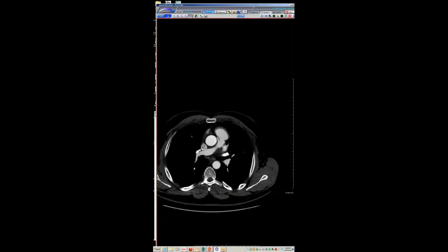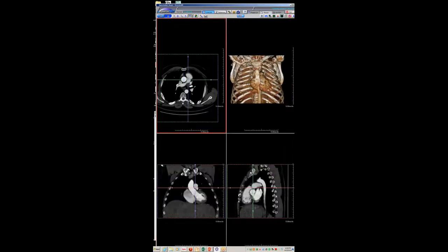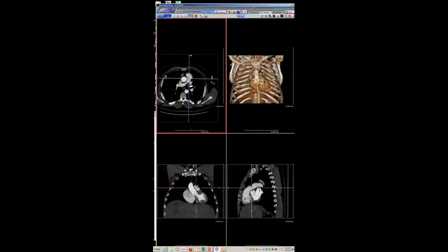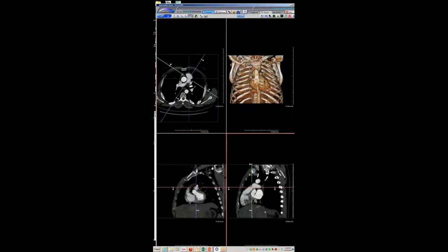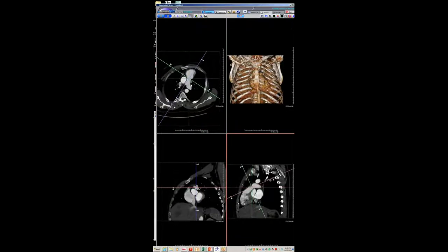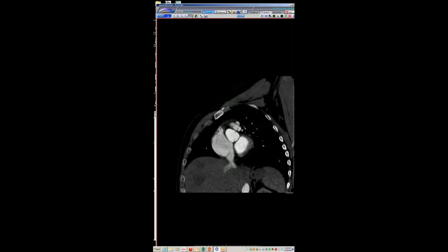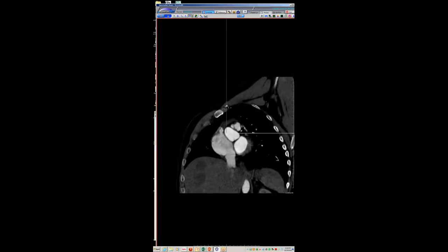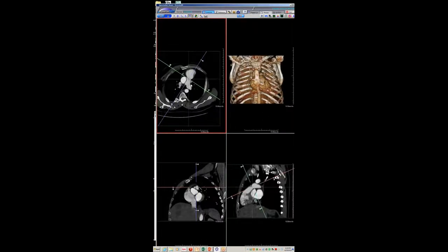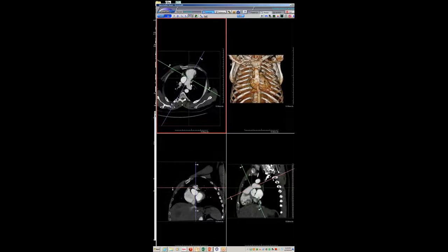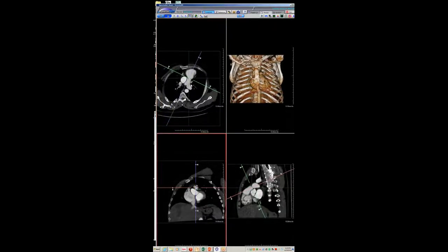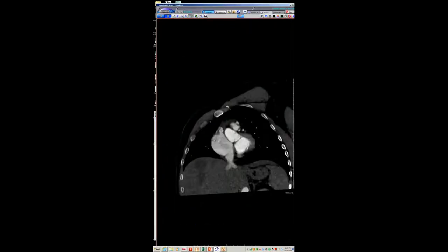On the CT, this is someone with metastatic carcinoid, and you can see here the thickening of the tricuspid valve, and then more pronounced, the thickening and irregularity of the pulmonic valve. I always tell people you should rarely ever see the pulmonic valve on normal CT studies. If you do see it, it should be very wispy and diminutive. Here it's quite thick and irregular, with three leaflets — the anterior, the left, and the right.